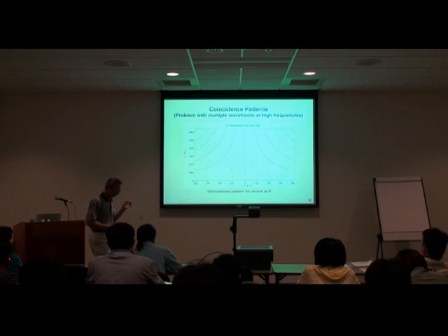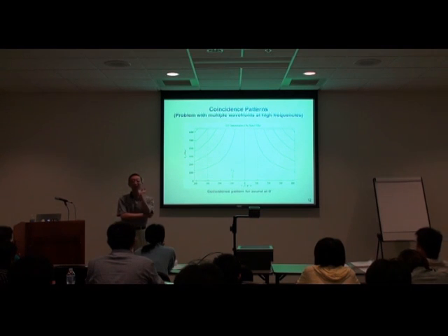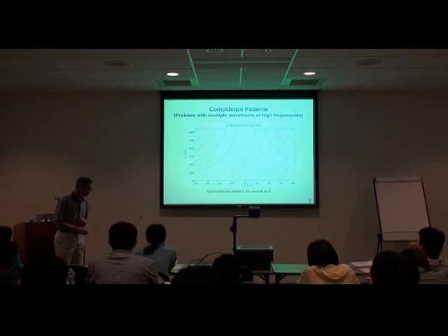So mathematically, the subtraction scheme works both to locate the sound as well as extract the signal from that location. As you know, in engineering, it always comes down to the equation, but the equation gives you the right solution. We were so fortunate in that regard, utilizing the frog's localization scheme, the subtraction scheme, to extract the signal as well as locate the sound.